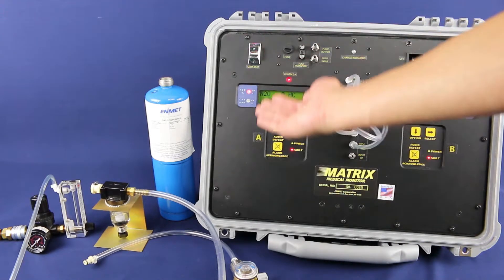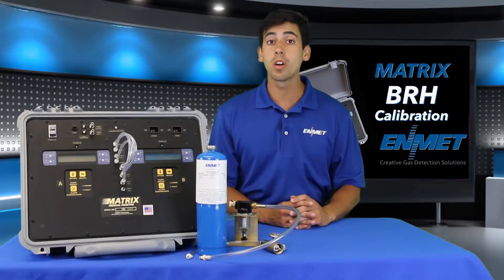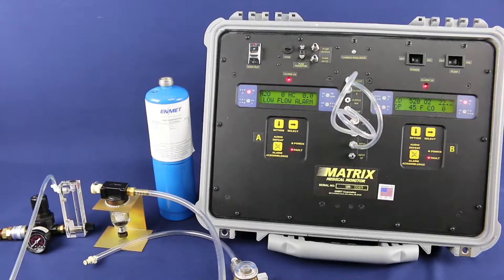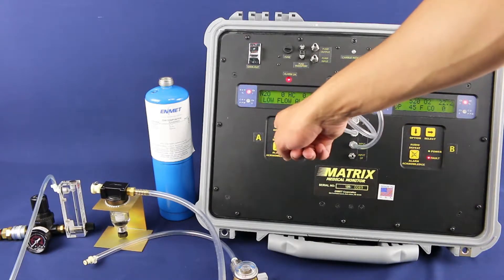Here we have a properly set up matrix unit that we are going to use to calibrate the BRH sensor. The BRH channel is located on side A channel 4.